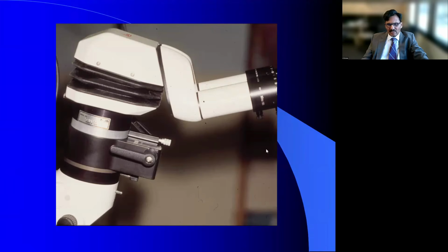So in addition to your lens, which increases the surface area that you see, your microscope increases the magnification so you can actually see the entire retina. And then this inverter, which is the third component, re-inverts the image so you can comfortably look at the posterior pole without having to worry about it and do whatever is necessary to accomplish the surgical goals.